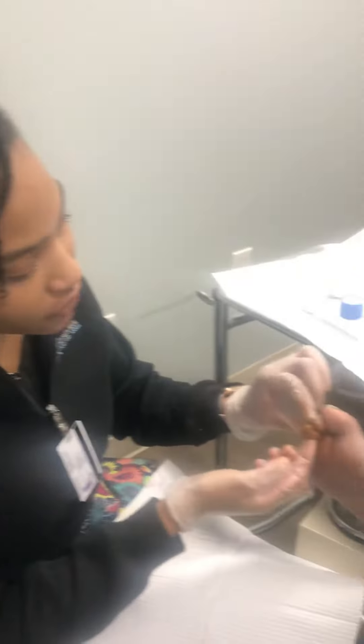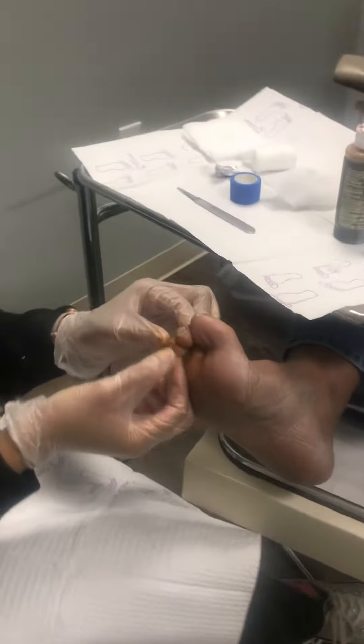I'm with Georgia Blue Foot and Ankle. Today we're going to do a flexor tenotomy. The reason we're going to do a flexor tenotomy is because my patient keeps developing ulcerations on the end of her toe.